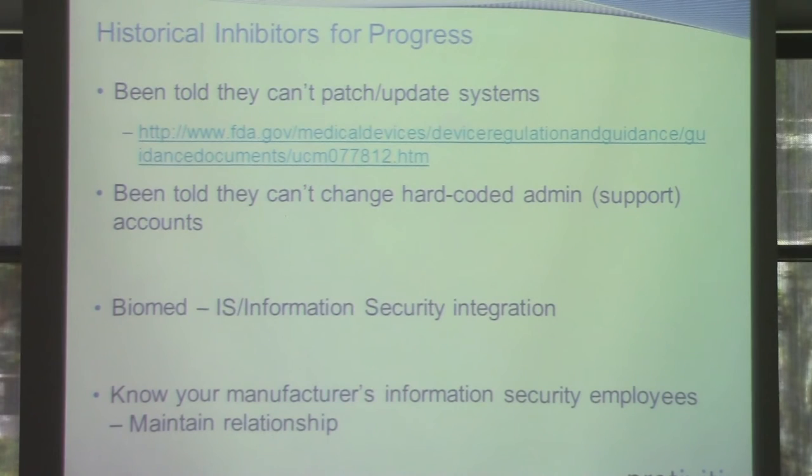Information security and biomed teams historically haven't talked to each other. You've had the biomedical equipment, and then all of a sudden network interface cards and Bluetooth and Wi-Fi have been put in, and they've stayed with biomed. They haven't started talking with information security.